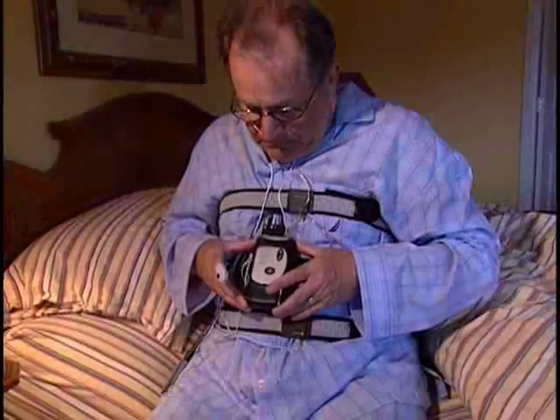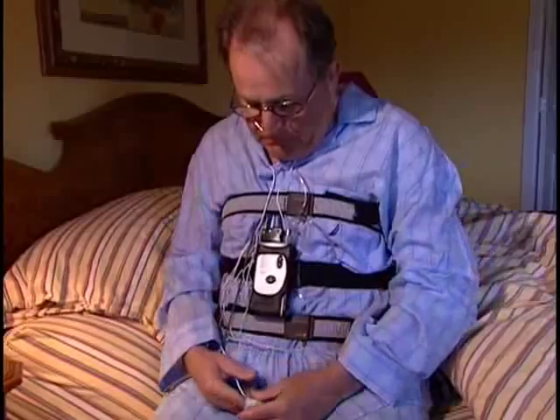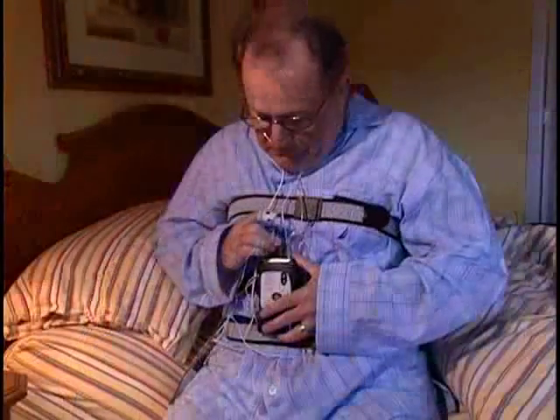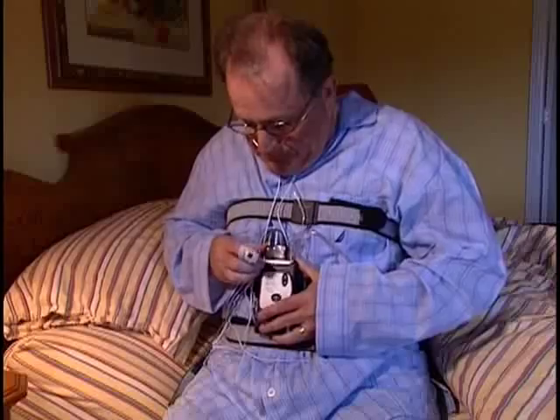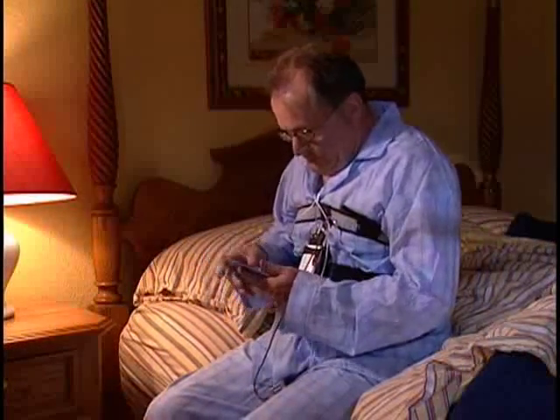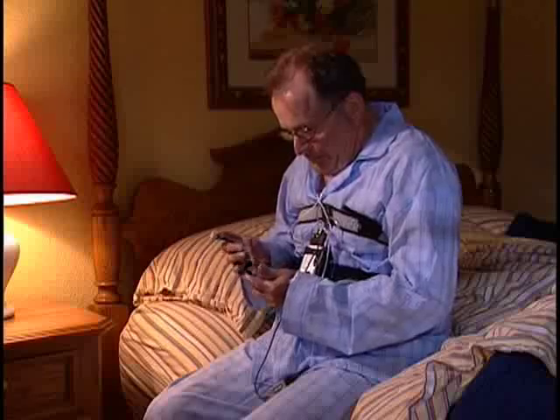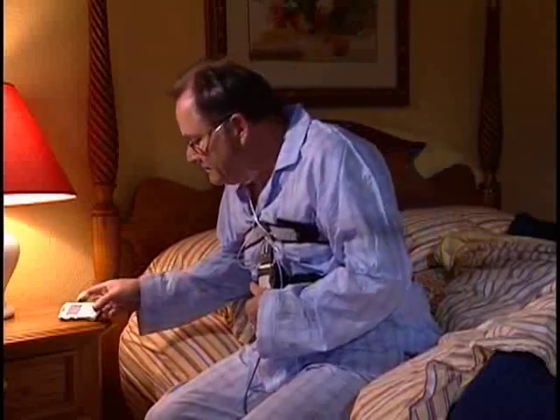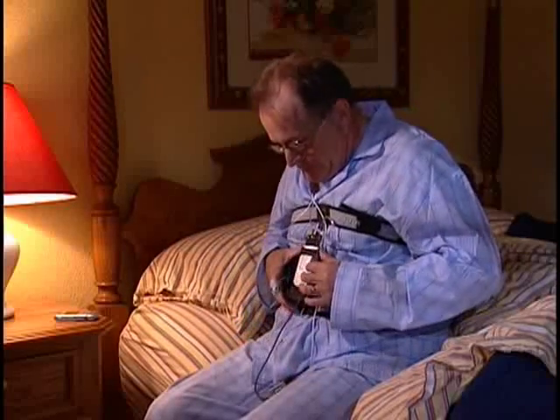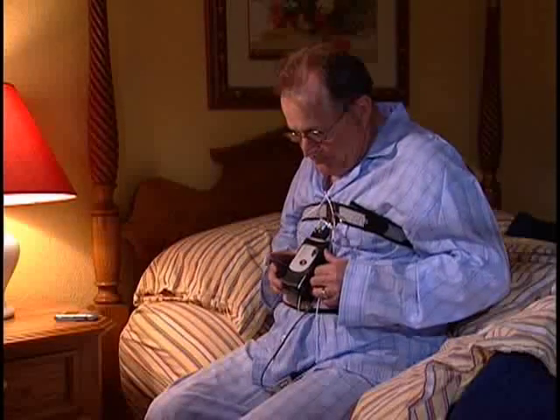When you are ready to go to bed, wrap the Embletta strap around your abdomen where it will be most comfortable while you sleep. Adjust the strap so that it is snug and secure. Check that the proxy is firmly connected to the Embletta. Turn off your cellular phone, as this may interfere with the recording. Check for a red light on the oximeter attached to your finger. Finally, check the indicator lights of the Embletta device.